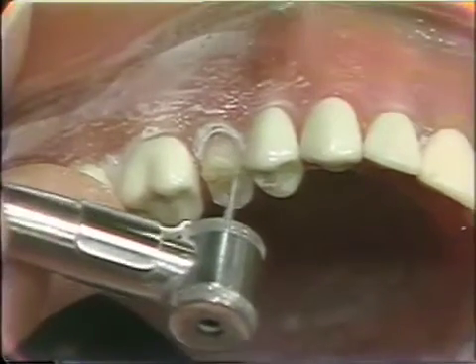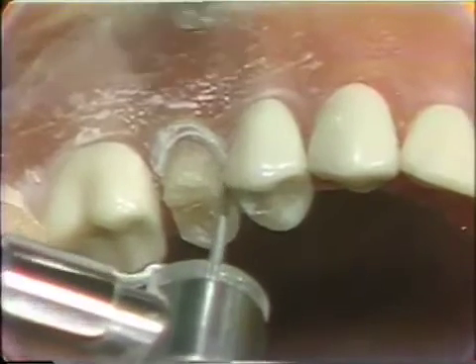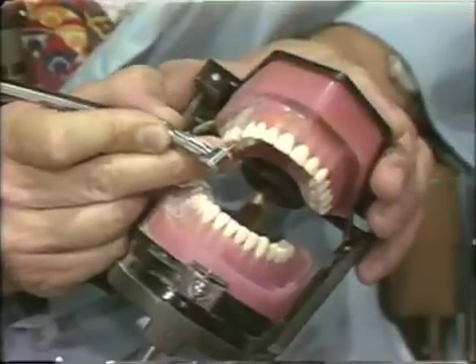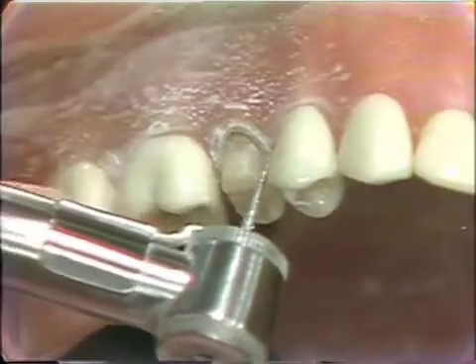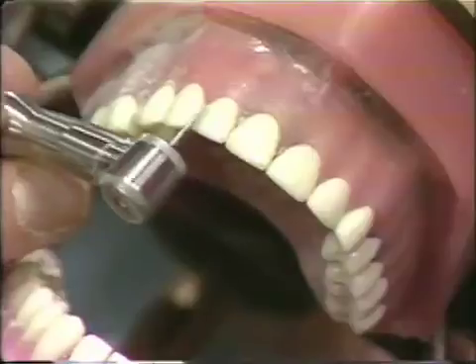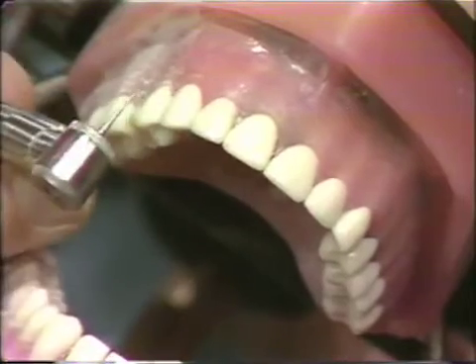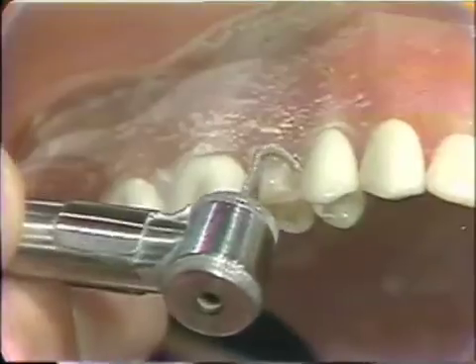That will go to the mesial and distal. With the same diamond, after you have sliced the mesial and distal, we will place a long bevel on the labial or buccal surface that will give us a gold collar. In the anterior part of the mouth we try to avoid a gold collar because the gold will show through the gingiva as a bluish-gray hue, and also when the gingiva recedes the gold collar will show. In the posterior, however, from the cuspids back, it is perfectly legitimate to use a gold collar, and this is the finishing line used most often on a posterior tooth.